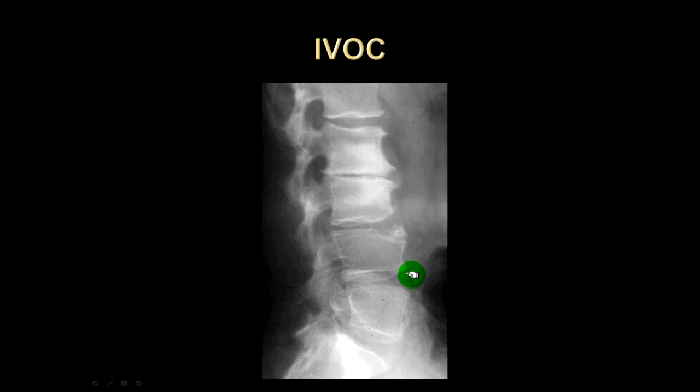The posterior portion of it is quite linear and well defined, and the anterior portion is less well defined, but there's an overlap of a large pocket of large bowel gas here. This is also another classic radiographic finding for calcification within the abdominal aorta and its tributaries. At this level, we're likely in the common iliac vessels, but there's no sign of aneurysm, and that's critically important.